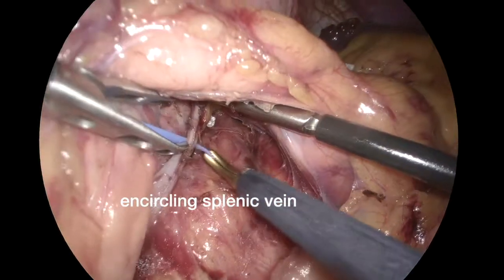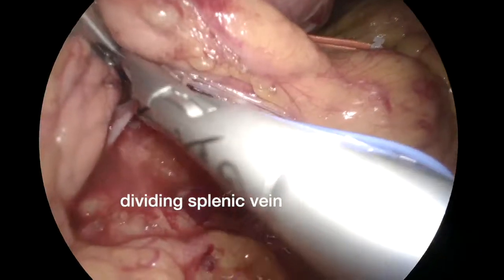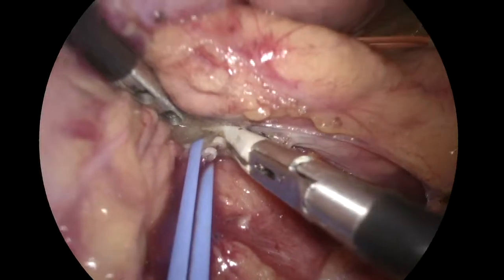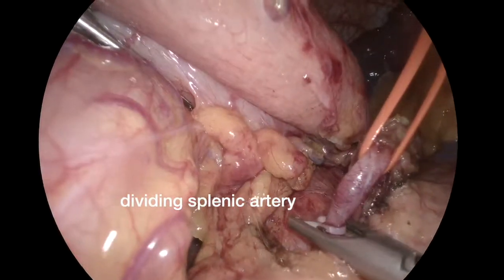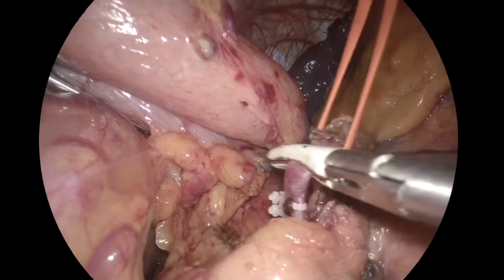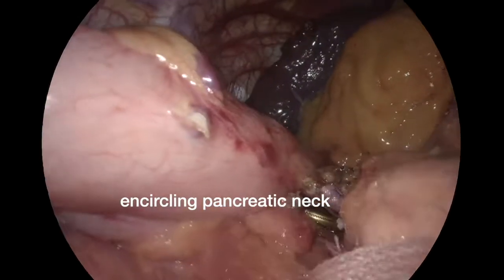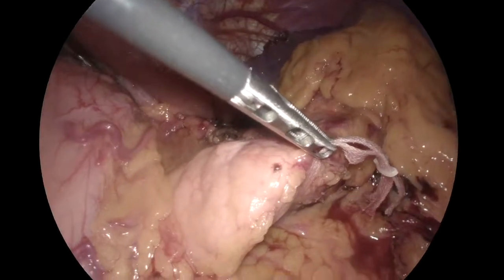After all splenic vessels were controlled and we were satisfied with the resection margin, the splenic vessels were then resected, starting from the splenic vein, followed by the splenic artery. The pancreas was encircled, then we continued dissecting the anterior RAMPS plane. The earlier dissection made the pancreas more mobile so that we could lift it up.